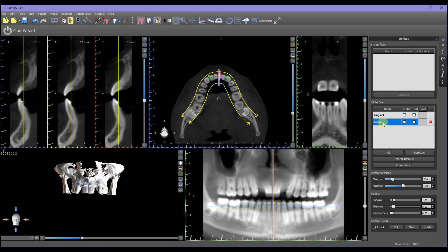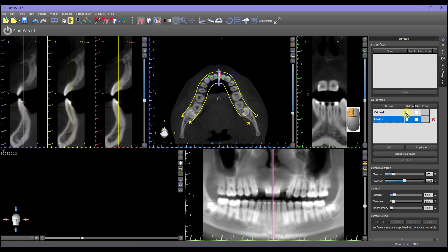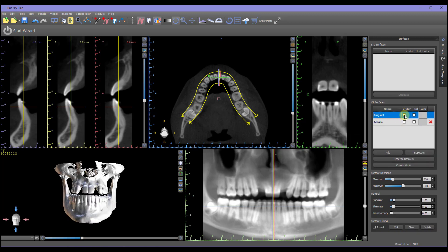Click Enter in order to save the name. Uncheck the Maxilla visibility, left-click on the Original visible checkbox, and repeat, now cutting out the maxilla.